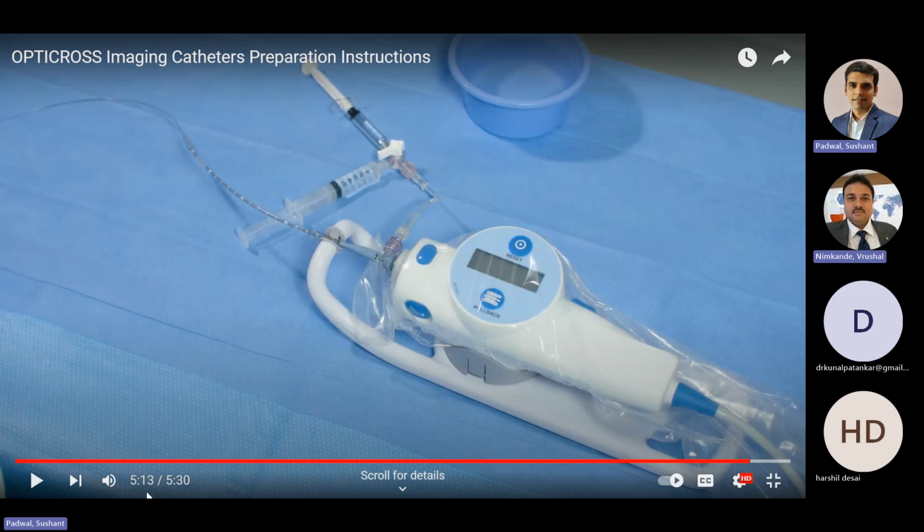So next time, Dr. Kunal or Dr. Harshil, after you do an IVUS case, spend some time on this. The display you see here, you reset it, start the imaging and start the pullback. The length displayed on this display will match the number of dots which are pulled out from here at the red marker. So next time you just watch it. If 3 dots are outside, you will see 30 mm of length here.